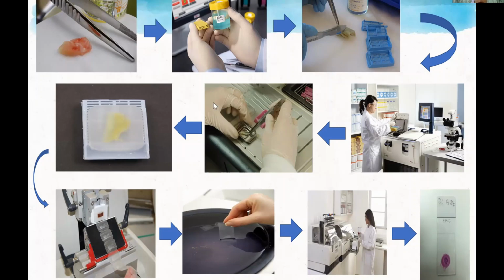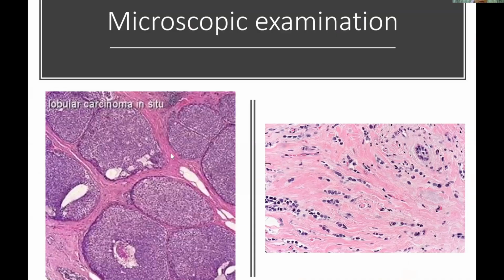Right. On examination, what we saw just now, we got the mastectomy specimen. What we saw on histology is all tumor tissue. This tumor tissue occurs in the lobules. It's lobules of tumor, with the myoepithelial cells still visible in the surrounding tumor tissue. So this is in situ, meaning this tumor has not invaded into the stroma yet. So we call it lobular carcinoma in situ.